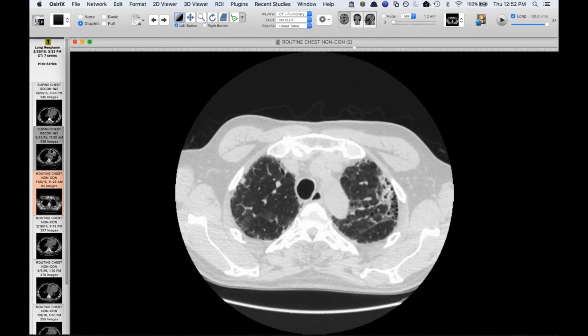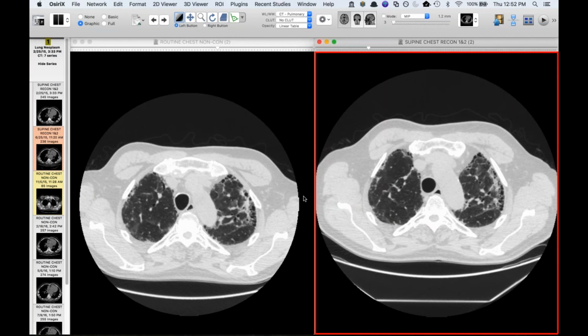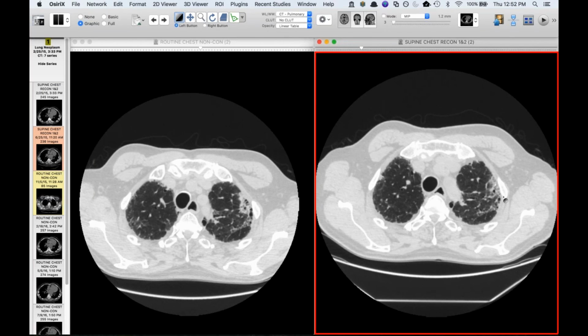And it really is unfortunate. I don't have the rest of the images, but I'll show you the prior study that I was comparing to, or it was, at least at this time, growing. You can see there's a little bit of ground glass there, and something in that area. And when you look back even further, maybe a little bit of ground glass, but not much in the way of soft tissue at all.